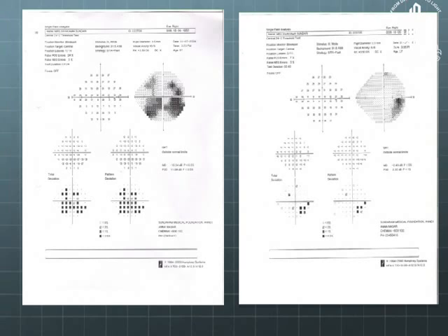The patient should be instructed properly as to what is expected of him in perimetry, and the instruction has to be given by the technician in a gentle, slow manner. You can even do a demo test for the patient and then subject one eye to the test, give a little rest, and do the other eye a little later. There is no need to rush a patient through perimetry, because what you will get out of 15 minutes may be something completely of no value at all to the patient and to yourself.